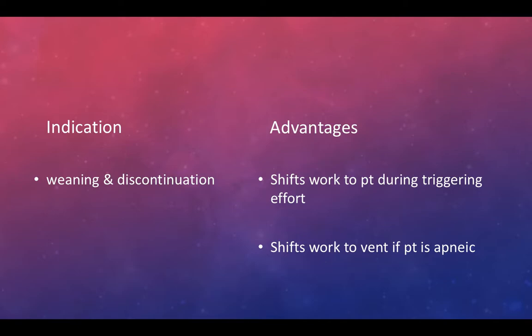Advantages of Automode: the work will be shifted completely to the patient after only 2 consecutive triggers. The work will be shifted back completely from the patient to the vent after an apnea period based on the patient category, as I mentioned in the last slide.